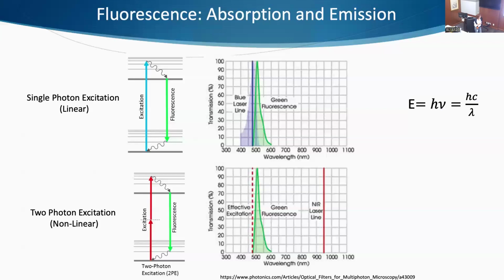So to have this process happening over the one above, you really need to work with high peak power, to have a lot of photons. And high peak power you create by using short pulses. So usually you will use femtosecond pulses, 10 to the minus 15.